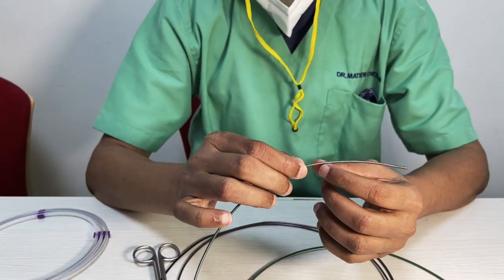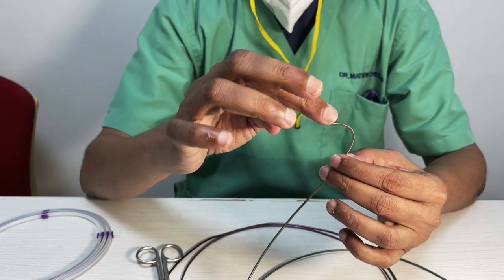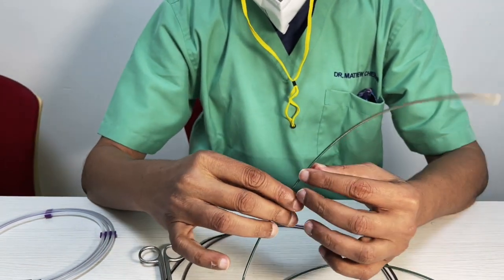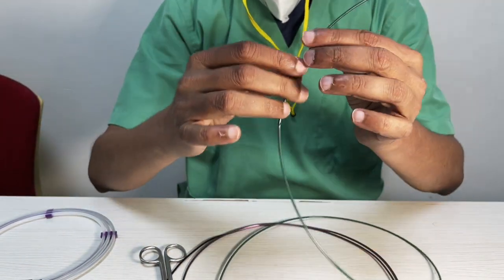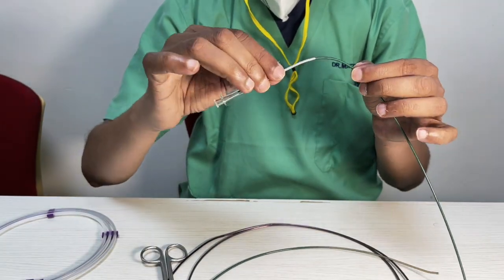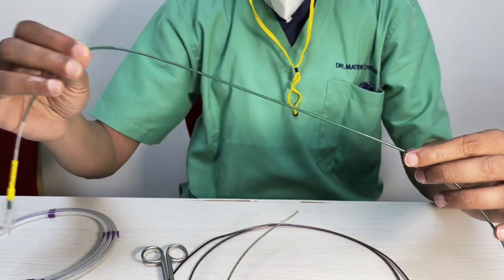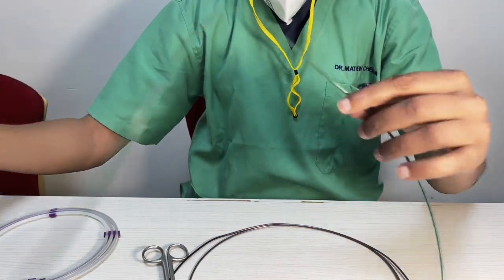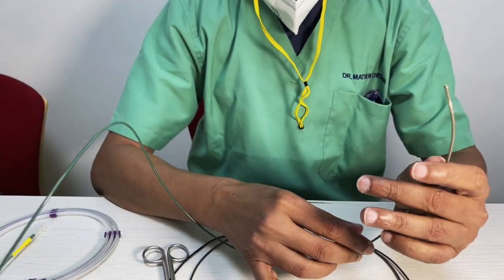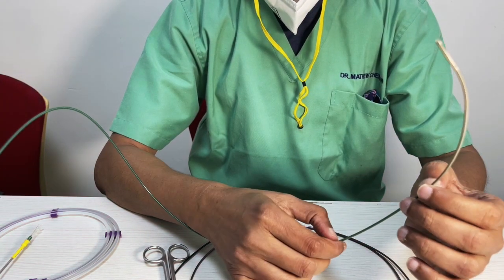Okay. So now it's very simple to understand. When I reduce the density of the braiding, then it becomes a lot more flexible, right? You can see that it's a lot more flexible, and as I go back, it becomes stiffer and stiffer, and right in the back, it is really stiff. So this is what we mean by variable transitions. The variable transition is created by a combination of 2 things. One, the density of the braid, and the second is the density of the polymer that they use.